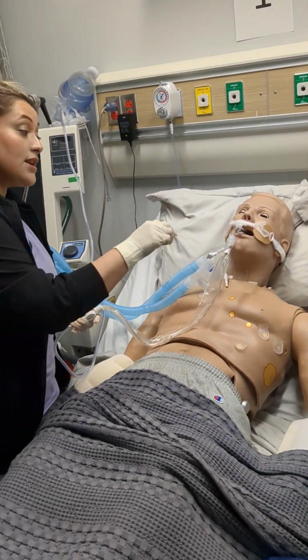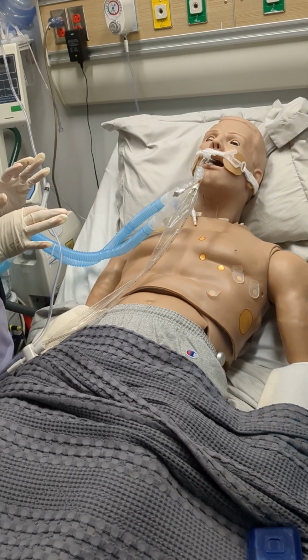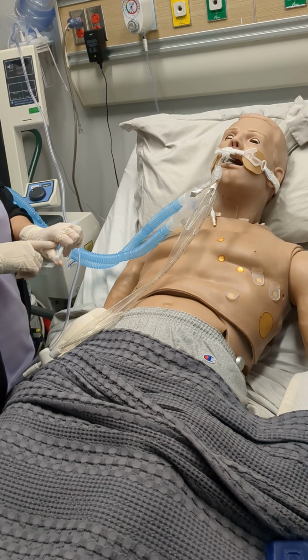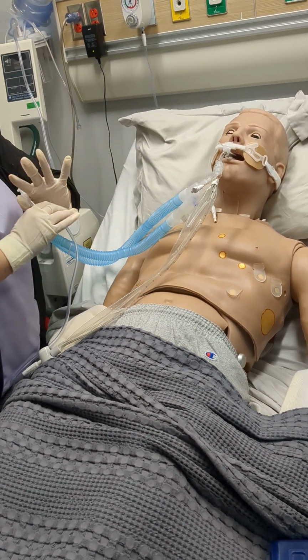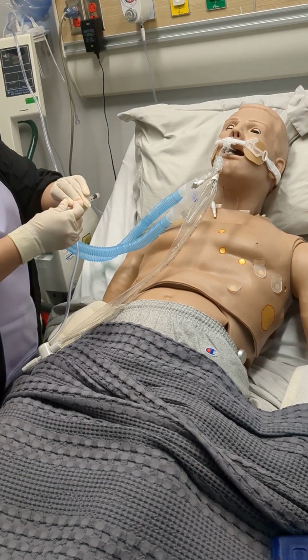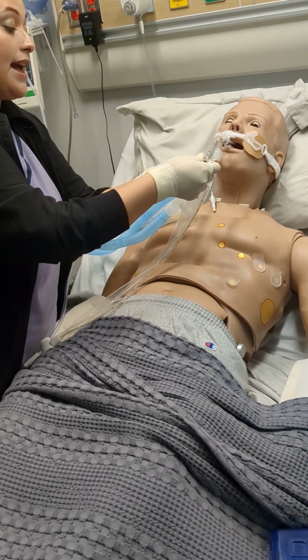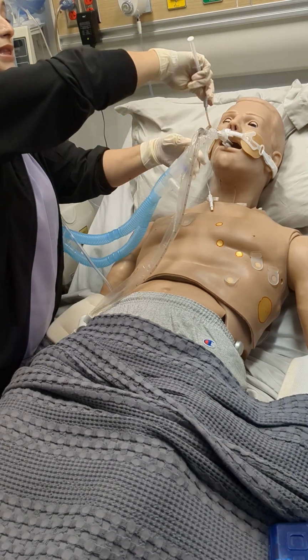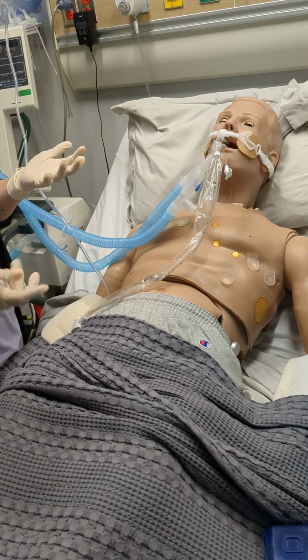Some people instill saline down the airway. That is not a safe practice, but there are going to be instances in which you might have to do it. Okay. But if they ask you, the answer is no. You do not instill saline down the airway, because I actually purposely push it so that it goes down the tube instead of the patient. Some people's thought process is that it loosens up the secretions.